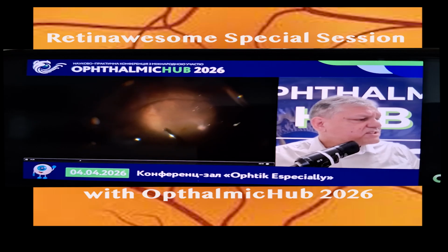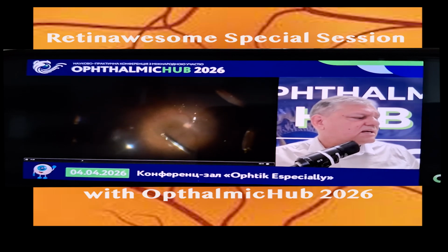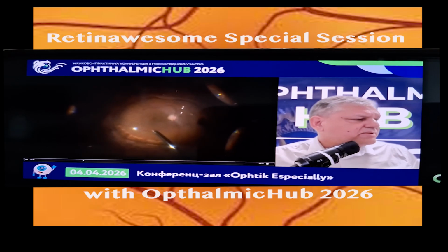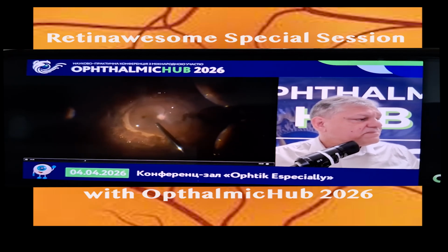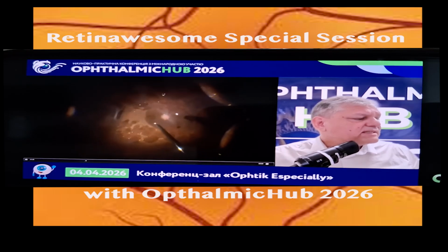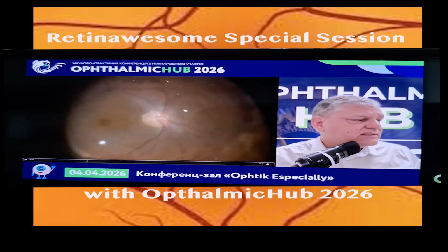At this moment, I'm going towards the retinal periphery to search for any defects on the retina, and in this case, I remove almost all the perfluorocarbon liquid.